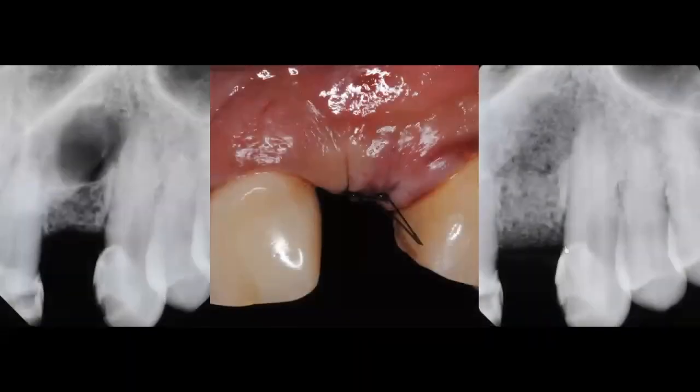And then we're going to see the patient back in maybe 2 to 3 weeks. We're going to just kind of see the site. I want to show you this x-ray. This x-ray was obtained right after the surgical procedure, so that you can see here the preoperative x-ray on the left hand side, the surgical side right in the center. But look at the x-ray on the right hand side.